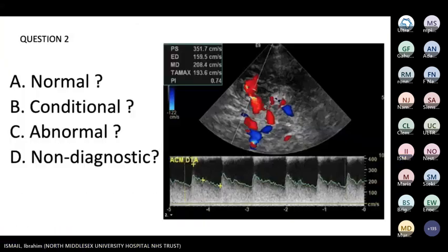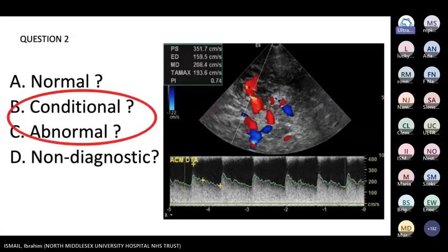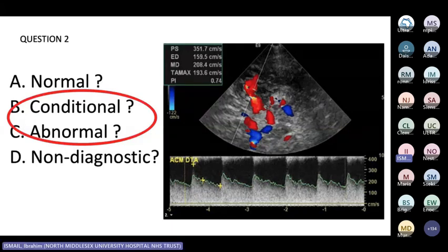It's MCA. And Clement asks, at what depth was this picked? This image here? Yep. Does it show on the image? It doesn't actually show on the image. I didn't take this image myself. This is just an image to see what our participants and colleagues are looking for in terms of velocities and the time average mean velocity. I don't have the depth on this image, unfortunately. Okay.